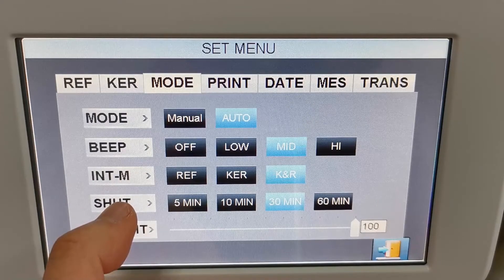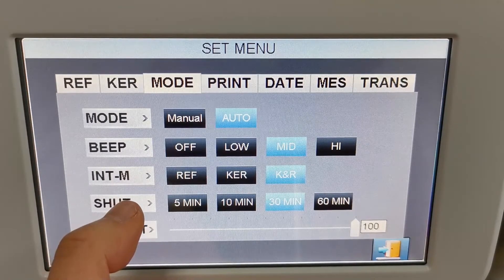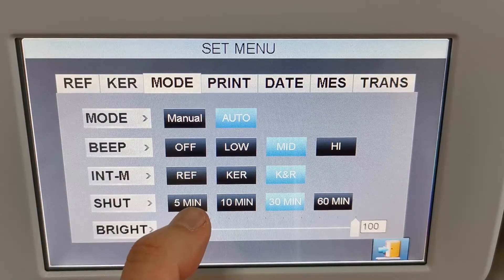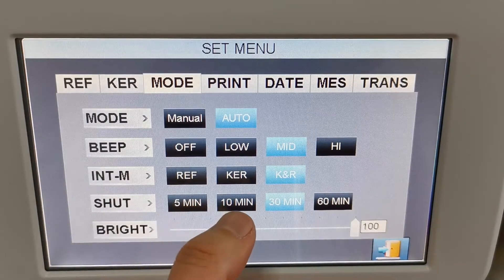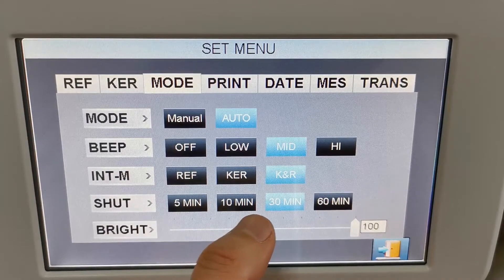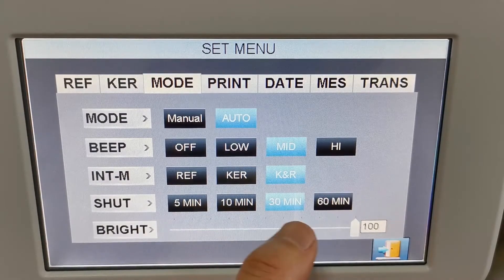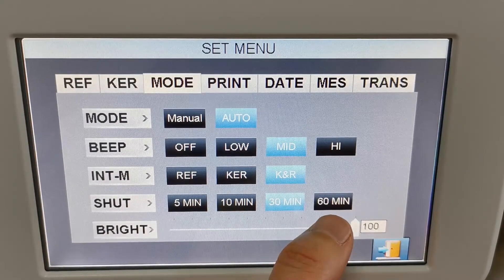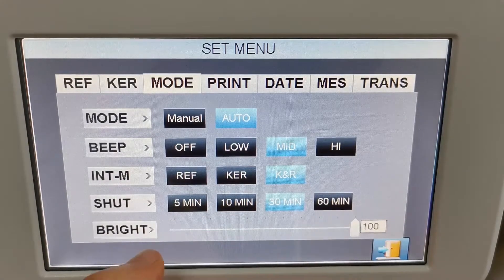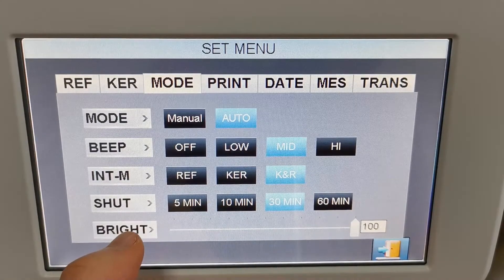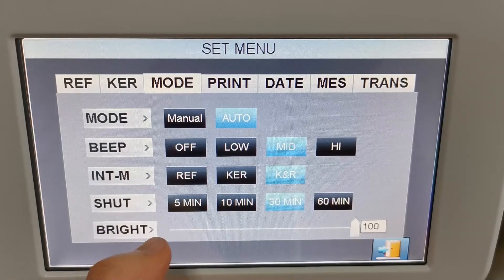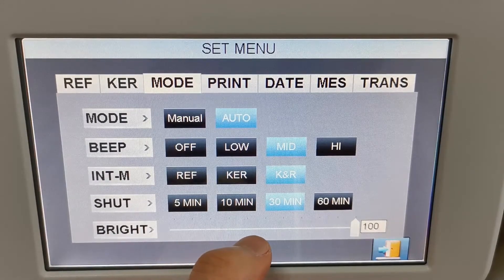Here is the standby function — the device will automatically go into standby in 5 minutes, 10 minutes, 30 minutes, or 60 minutes. And the last one is the brightness control for the screen.